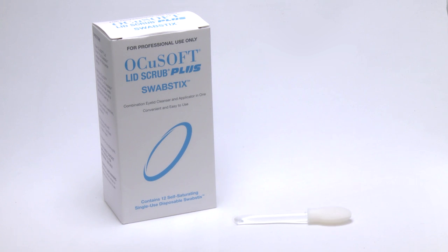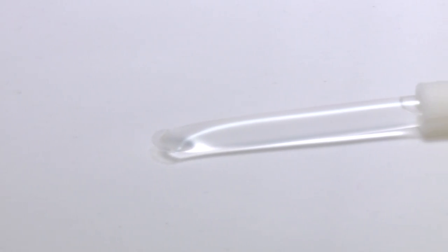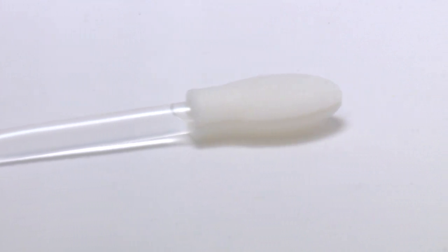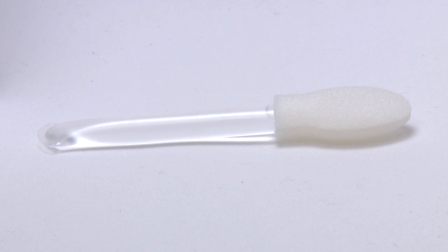OkiSoft Lid Scrub Plus swab sticks are self-saturating disposable applicators conveniently prefilled with OkiSoft Lid Scrub Plus formula in the handle and a PVA swab applicator at the tip for gentle use. This combination eyelid cleanser and swab applicator in one is designed for convenient in-office treatment of blepharitis conditions, MGD, dry eye, and pre-surgical cleansing.